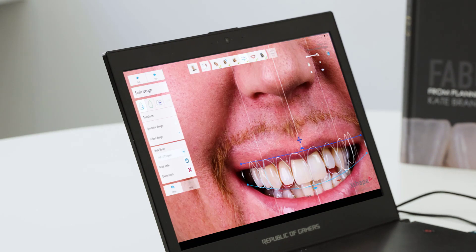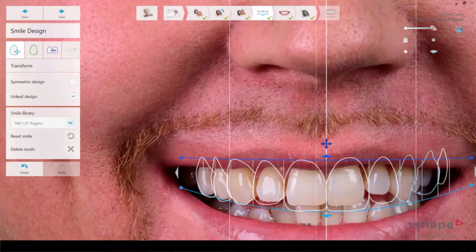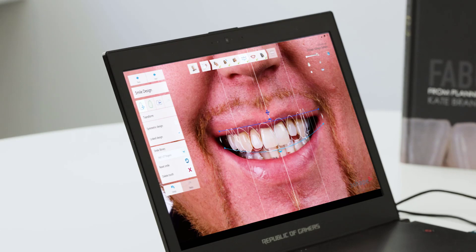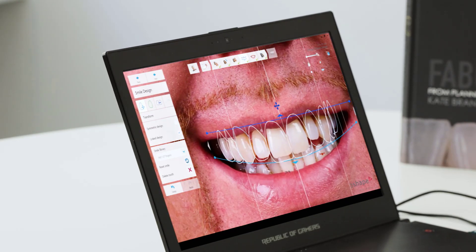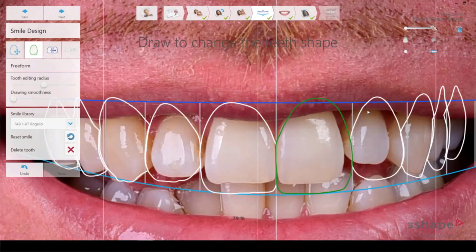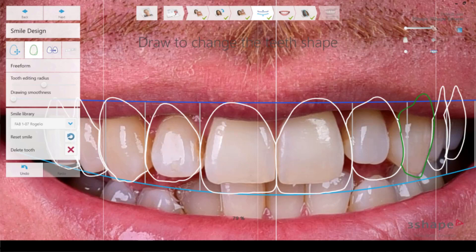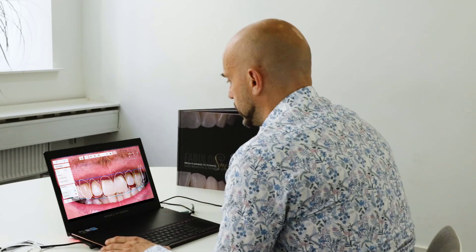We can see that this lateral is quite big compared to the other side, so we make it a little less wide, then follow up with the premolars. Our design is almost in place. I changed a little from the smile libraries intentionally, because we need to fit them to the patient as well. I draw a little bit outside the tooth outline; otherwise you will see a dark shadow from the original tooth, and we can hide it by morphing the library slightly.